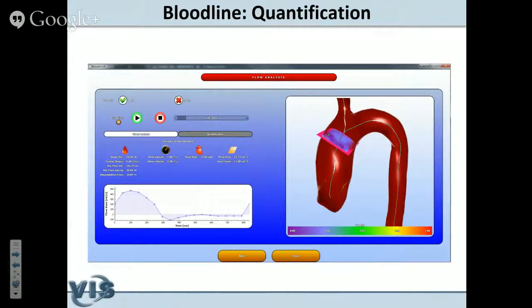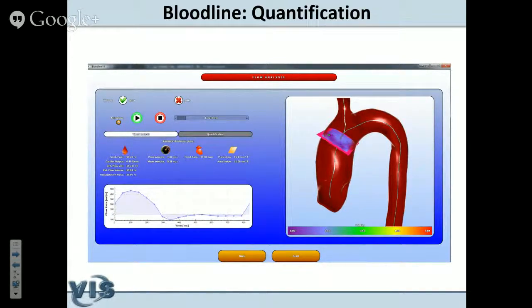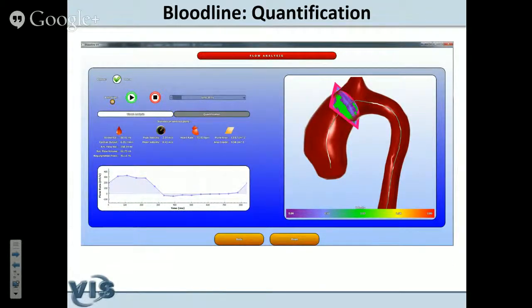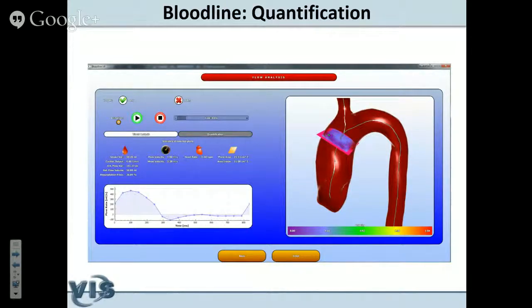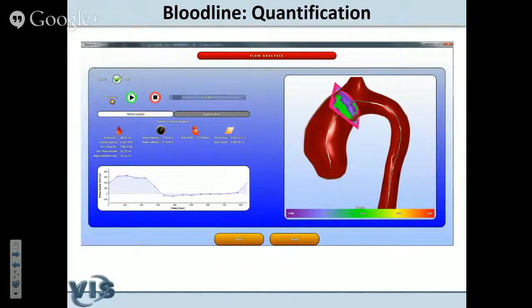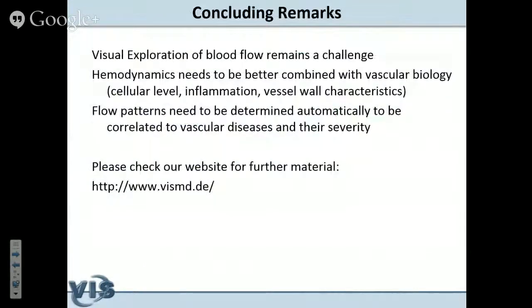There is a lot of functionality to import and preprocess data. There is a graph cut-based segmentation of these 4D data to show the flow inside moving dynamic vascular structures. People can place a plane inside the aorta and see how flow speed and flow rate change over time — similar to evaluations available in commercial tools like Siemens or Philips — but those tools cannot automatically classify vortices or helical flow. A lot of quantification takes place. An interesting measure is the regurgitation fraction — how much flow goes in the wrong direction, particularly close to a valve. More than 5% is critical and often indicates that surgery is important.